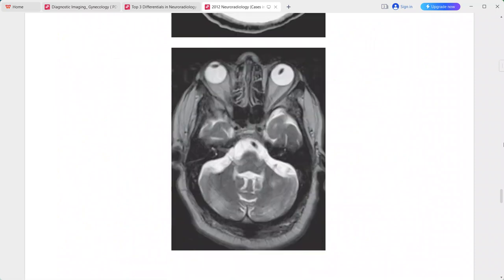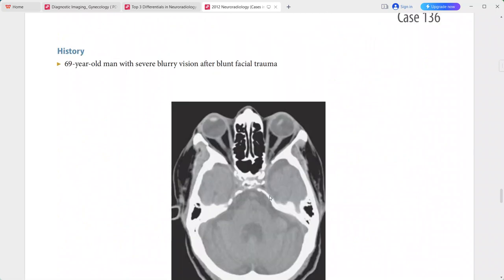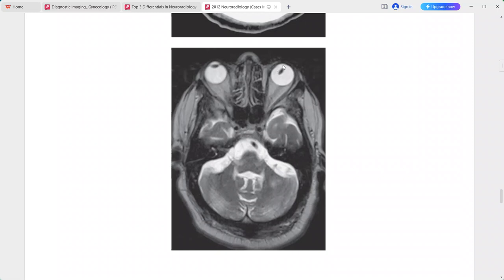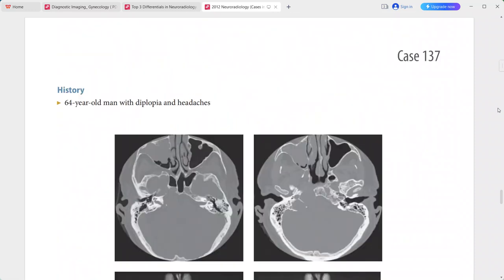A 69-year-old man presenting with severe blurred vision after blunt facial trauma. The axial CT scan and T2-weighted MRI show posterior dislocation of the left ocular lens. This is a specific finding; differentials include traumatic lens dislocation or connective tissue disorders such as Marfan syndrome, Ehlers-Danlos syndrome, homocystinuria, hyperlysinuria, and hereditary ectopia lentis.